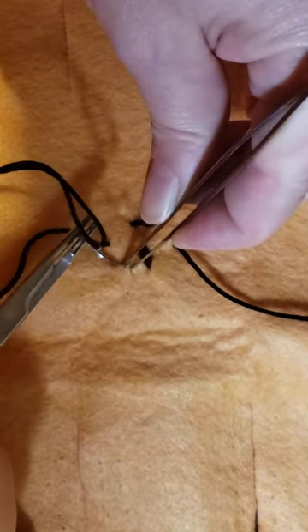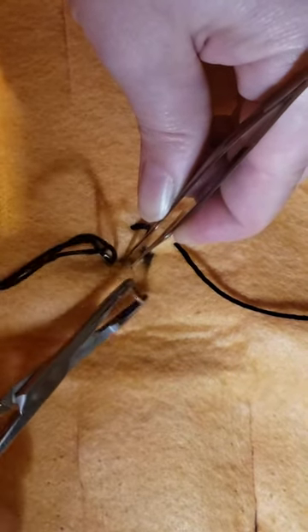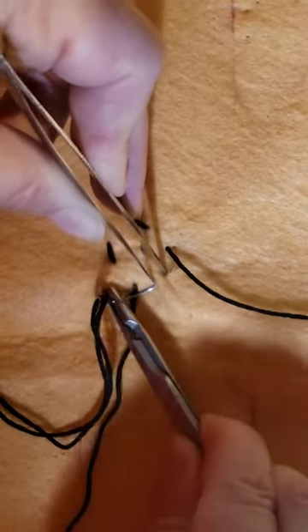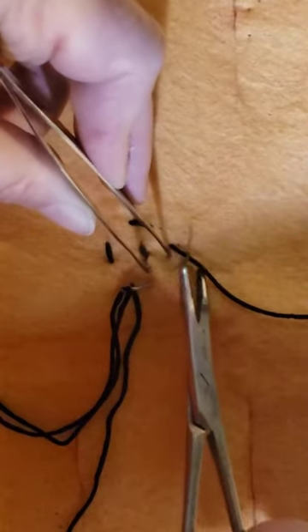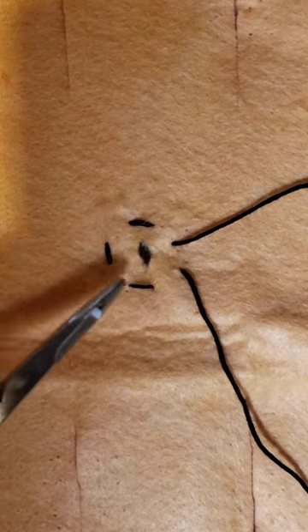I'm going to grasp tissue for my next bite. I'm going to insert, bring my needle back out, and I'm going to try to keep my pattern even all the way around the rectum or opening. Now I have space to do one more bite. So again, I'm going to grasp tissue. I'm going to go in and come back out. Now, before I tie it off, you can see how I went in, out, in, out, in, out, in, out. And I've made a little pattern to go all the way around.